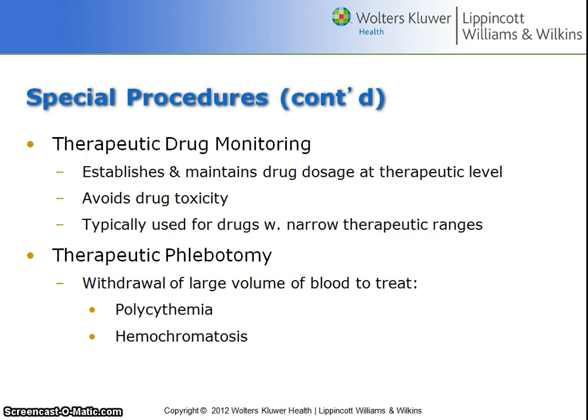Therapeutic phlebotomy. This is simply phlebotomy for phlebotomy's sake, pretty much. It's withdrawal of large volume of blood to treat polycythemia and hemochromatosis. There won't be any tests performed if you're doing it for these reasons. This is just because the actual removal of blood is the therapy.